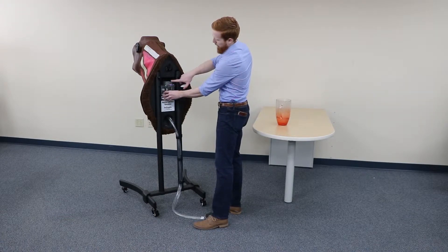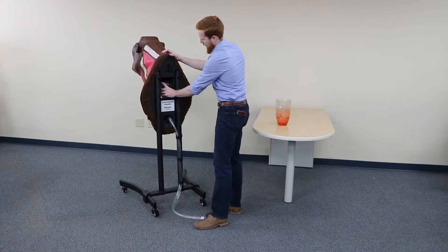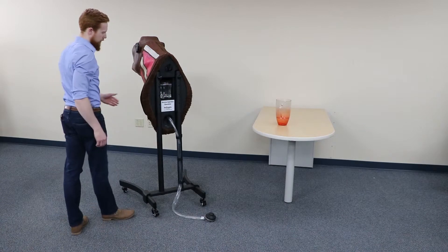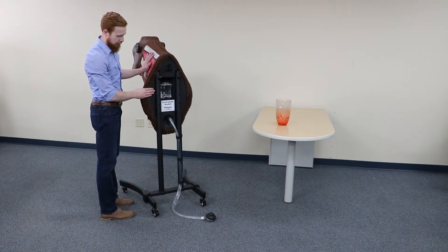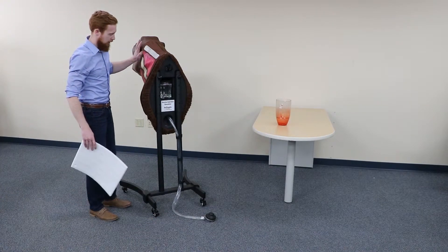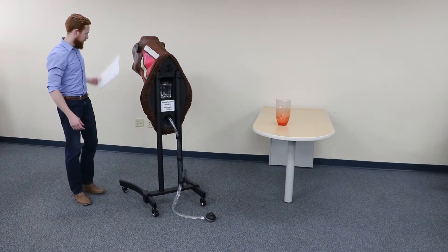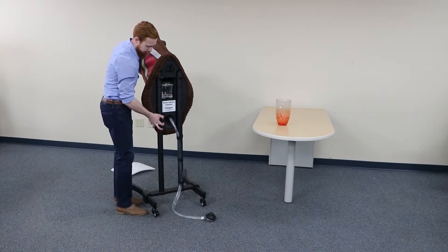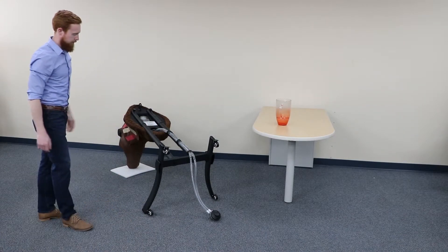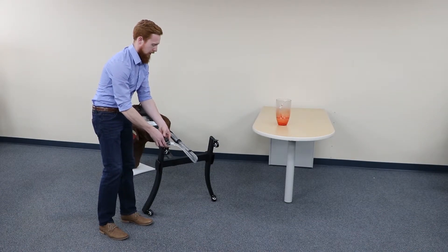Fill it to within about an inch of the top, screw the cap back on nice and tight, and seat it in there. Now we're going to flip it over. To get the air all the way out of the system — the plumbing inside of the injection trainer — we're going to actually tip it onto its nose. If you're on a concrete surface that might scratch up the fiberglass the head's made out of, you can take a foam pad just to protect the nose. We'll carefully tip it over until it rests just like that, then take our foot pump and compress it about 10 times until we get all the air out of the system.